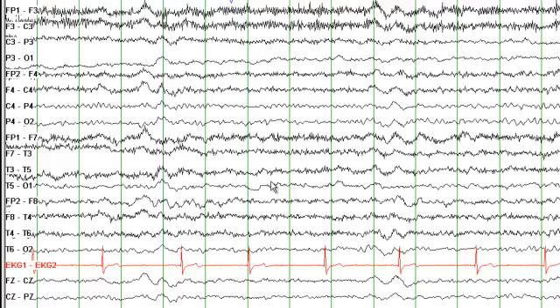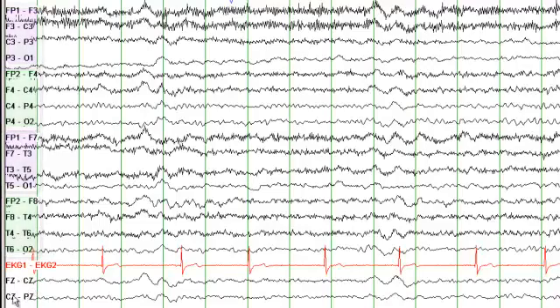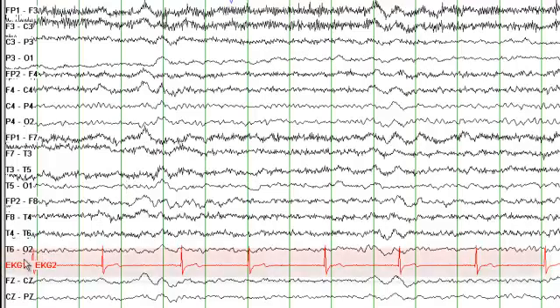This is the EEG. Most of you have seen EEG in the past — odd numbers represent recording from the left side, even numbers from the right side, and the electrodes that end with Z are recording from the midline. And obviously this is the EKG channel, so you can see the EKG rate and rhythm here.